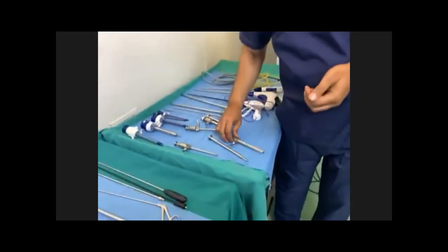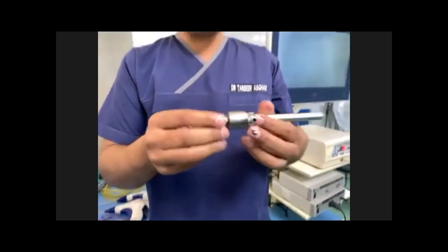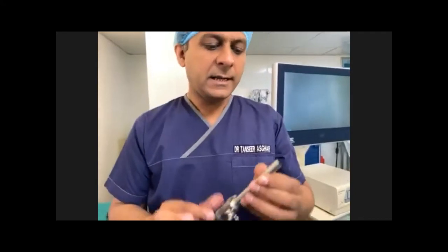Now coming on to the cannula. The cannula has different components, and different companies promote it in different manners. You can see small holes over here.